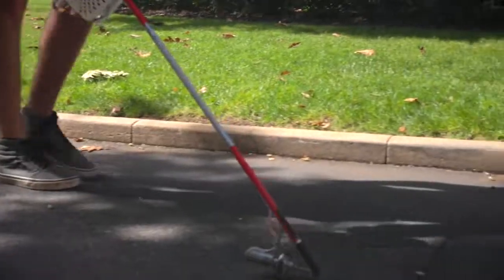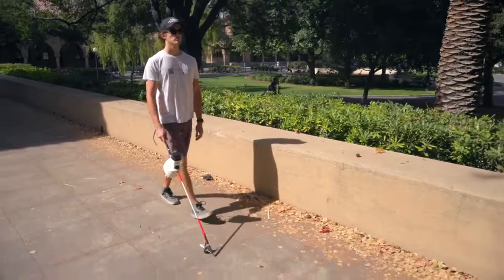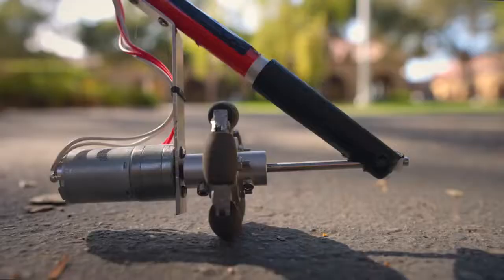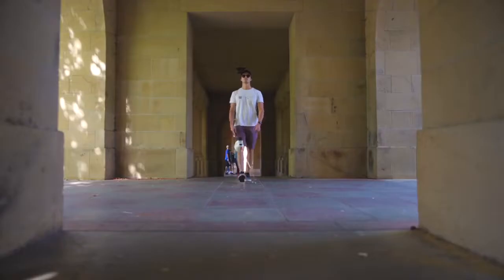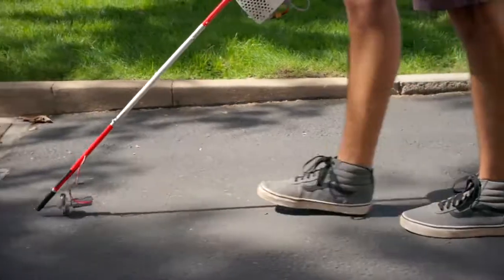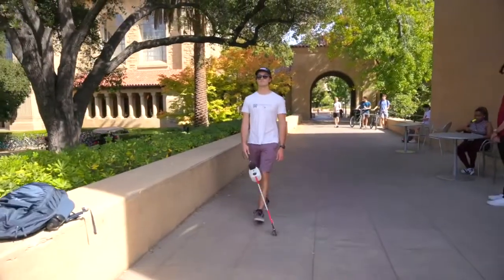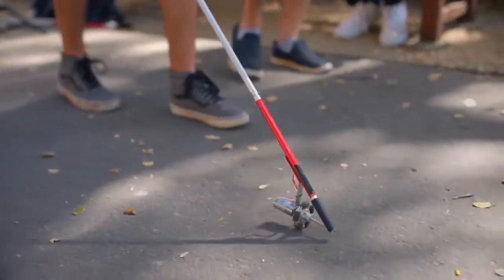The augmented cane is not the first smart cane. Research sensor canes can be heavy and expensive, weighing up to 50 pounds with a cost of around $6,000. Currently available sensor canes are technologically limited, only detecting objects right in front of the user. The augmented cane sports cutting-edge sensors weighing only 3 pounds, can be built at home from off-the-shelf parts and free open-source software, and costs $400.